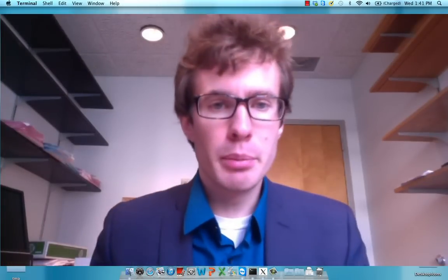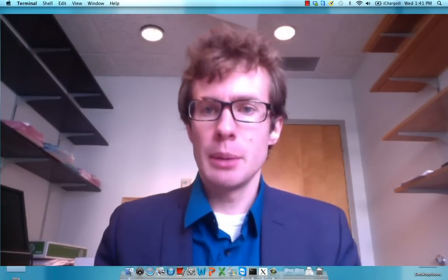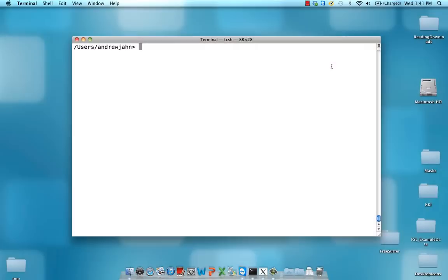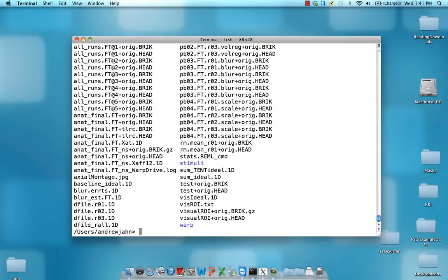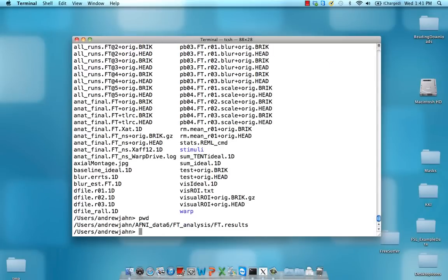I'm going to do a very brief example using the AFNI dataset 6, as you can see right here—AFNI data 6, the one that's available online.